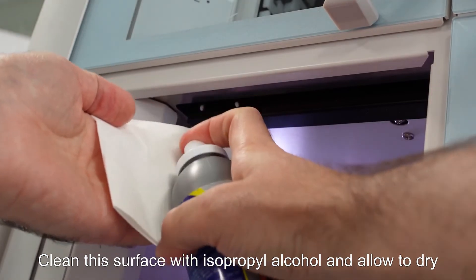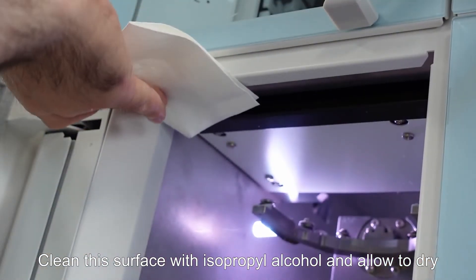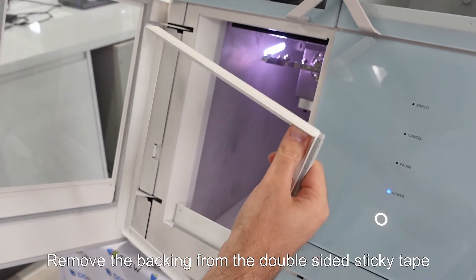Clean this surface with isopropyl alcohol and allow to dry. Remove the backing from the double-sided sticky tape.